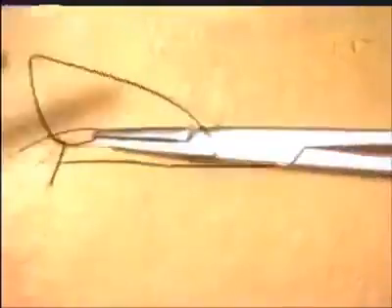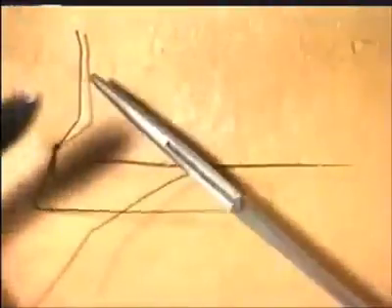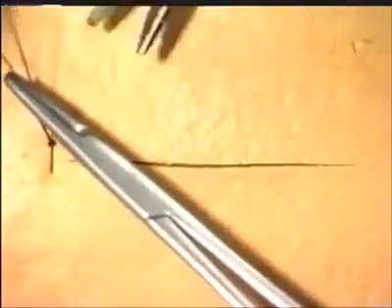Pull the suture through gently without snagging it. Secure a standard reef knot, either using the one-handed technique or the instrument technique. Cut the suture to such a length as will allow it to be grasped for subsequent removal.